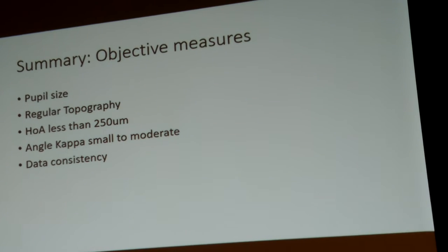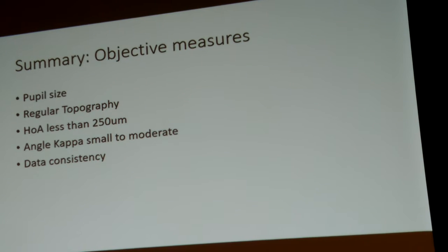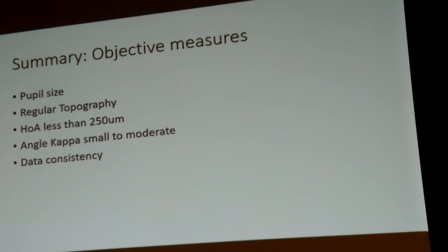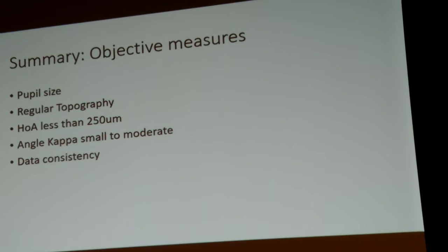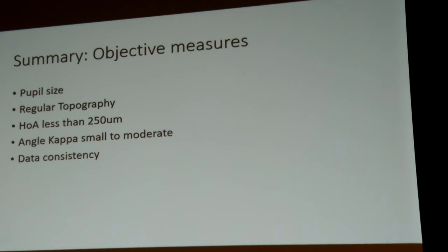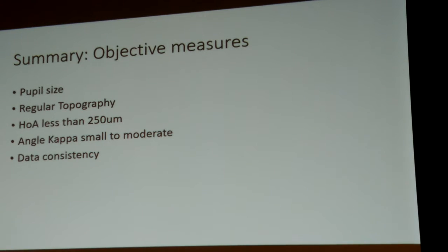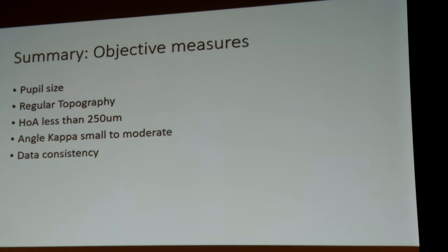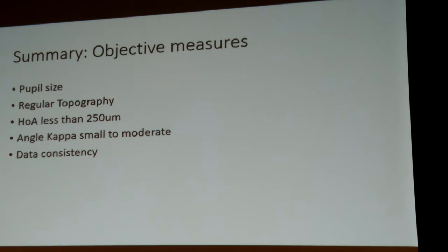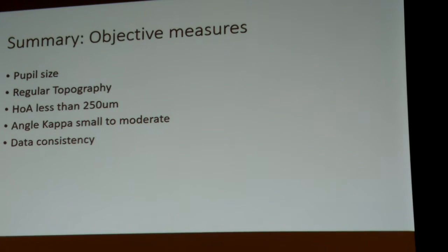If you have young patients with really large mesopic pupil sizes, it's for us a contraindication for multifocal, because dysphotopsia and any strange light sensation at night will be almost for sure. So then we go for a monofocal or a toric lens, but no multifocal. How large a pupil size? Greater than 6, because all the lenses we're using have an optic size of 6 millimeters. So after 6, we go for monofocal.